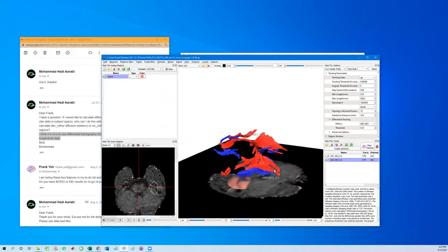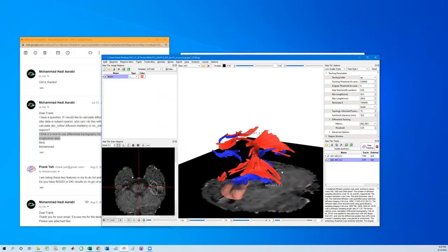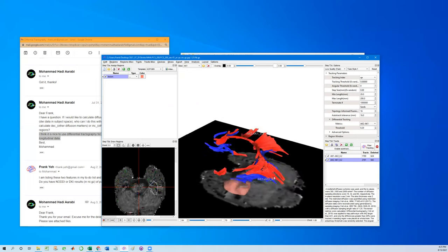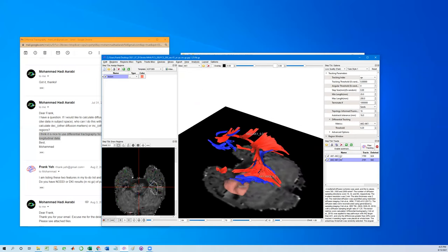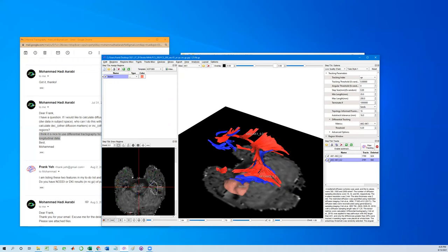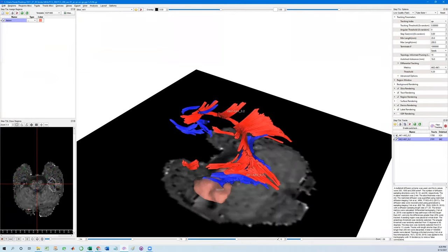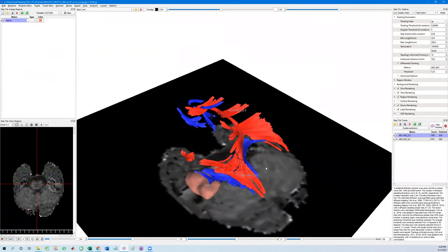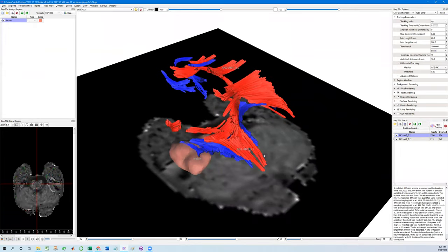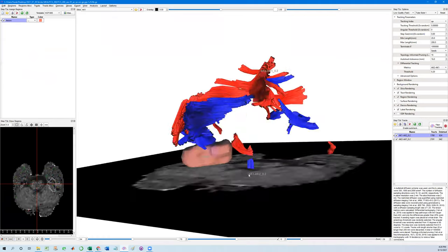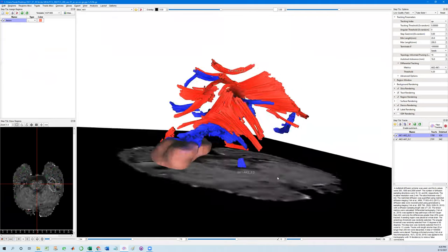So as you can see here, I applied two differential trackings. One is increase, labeled by red. Another one is decrease. And this allows us to show the axial kurtosis difference between these two scans.